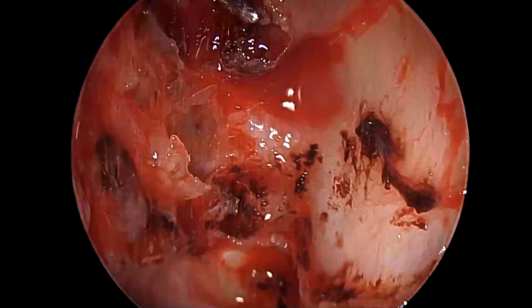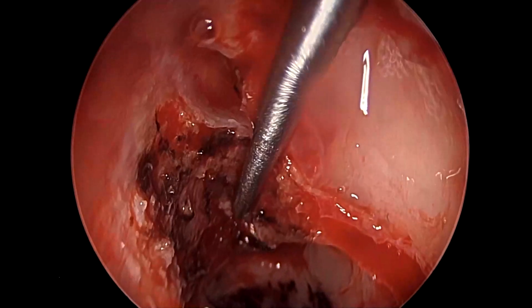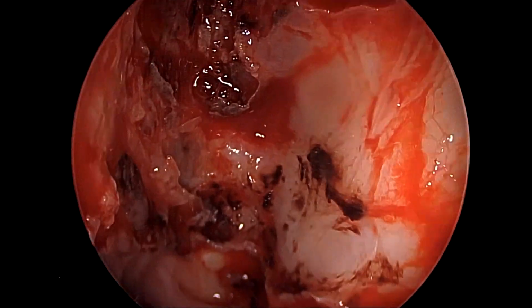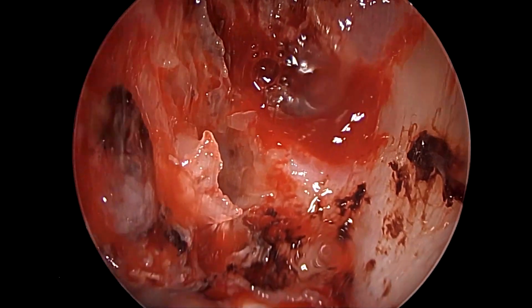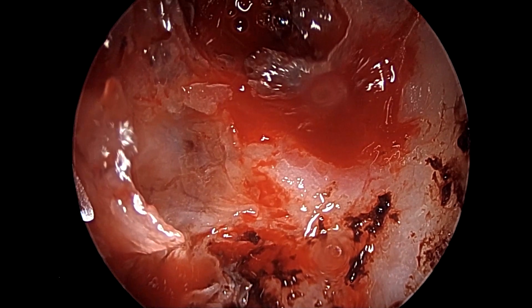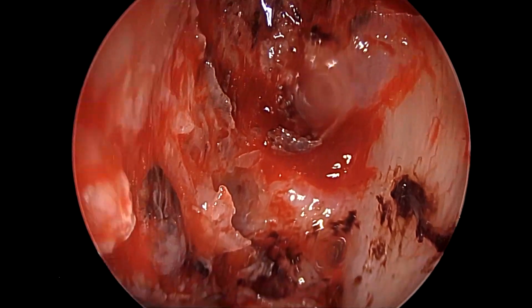And contrary to popular thinking, it is easier to place graft materials in larger defects as compared to smaller ones. In smaller ones, our graft materials or our fascia is bound to get curled on itself, not be taut, not be straight, and hence would always lead to poor outcomes. We can see here that the thin bone on the skull base is being removed slightly, chipped off.